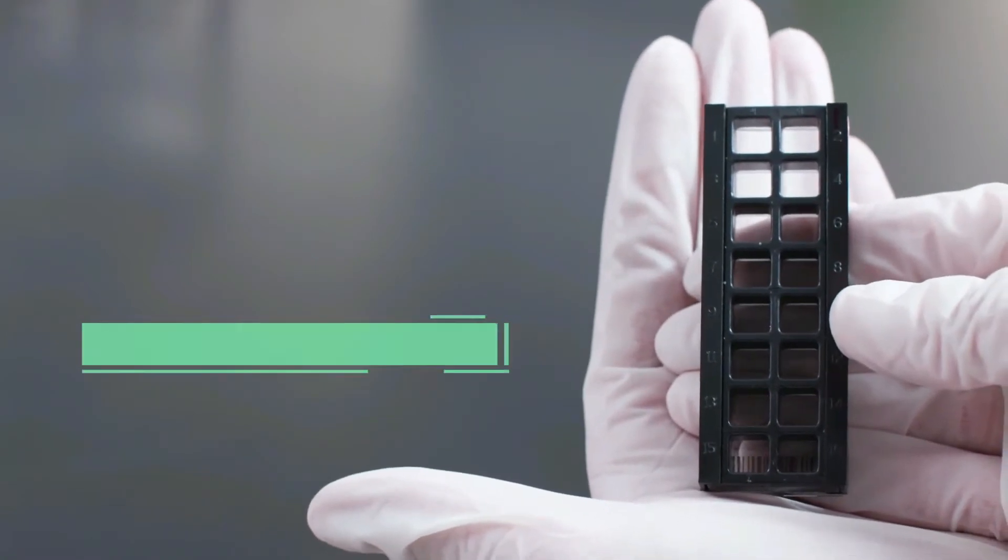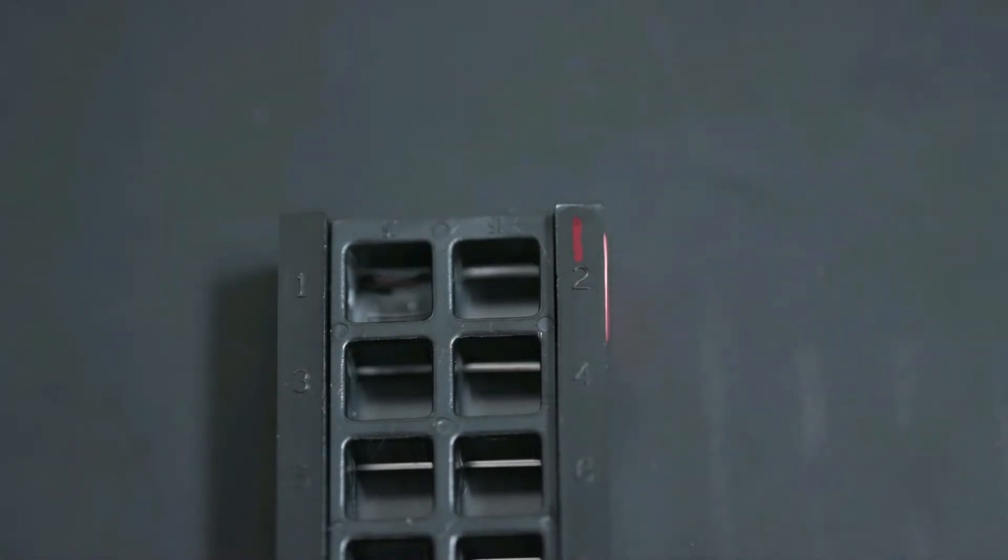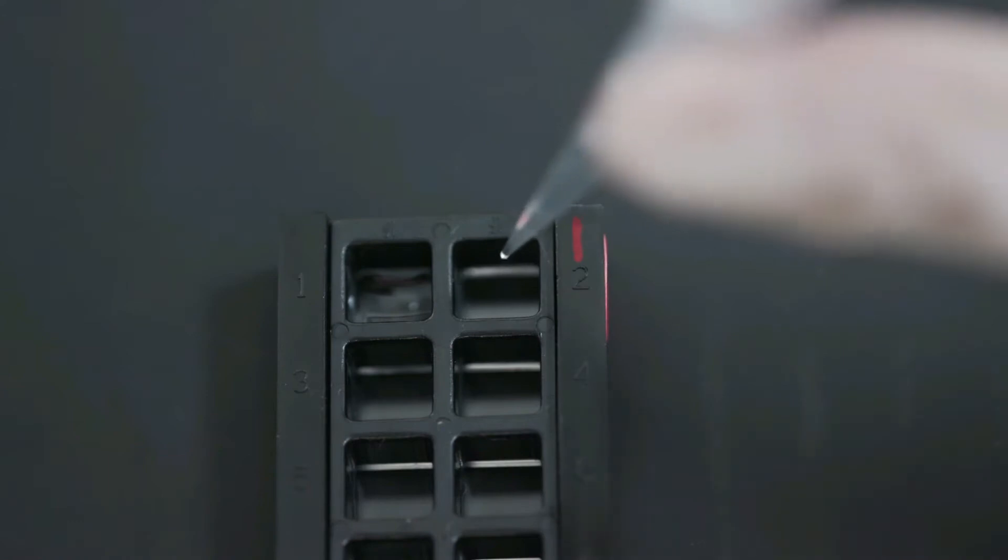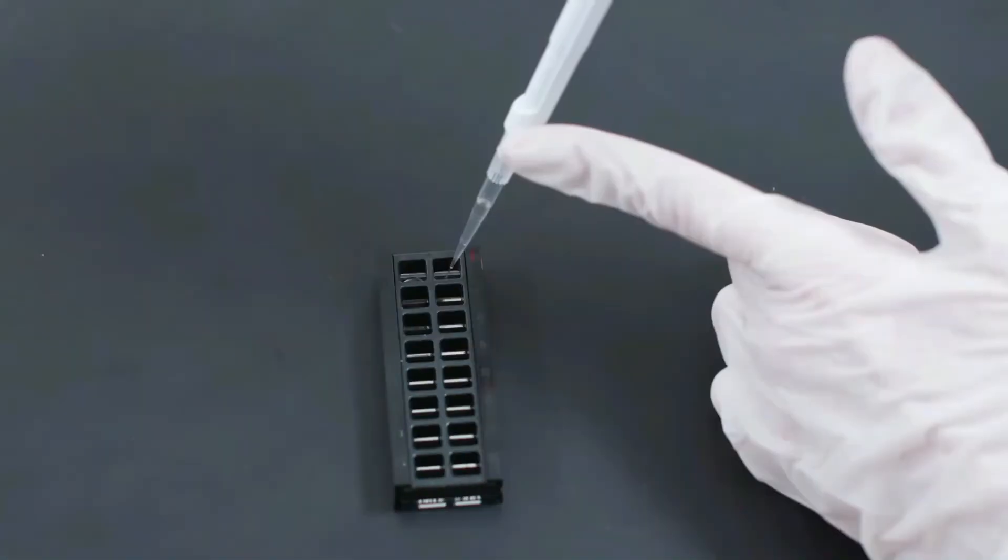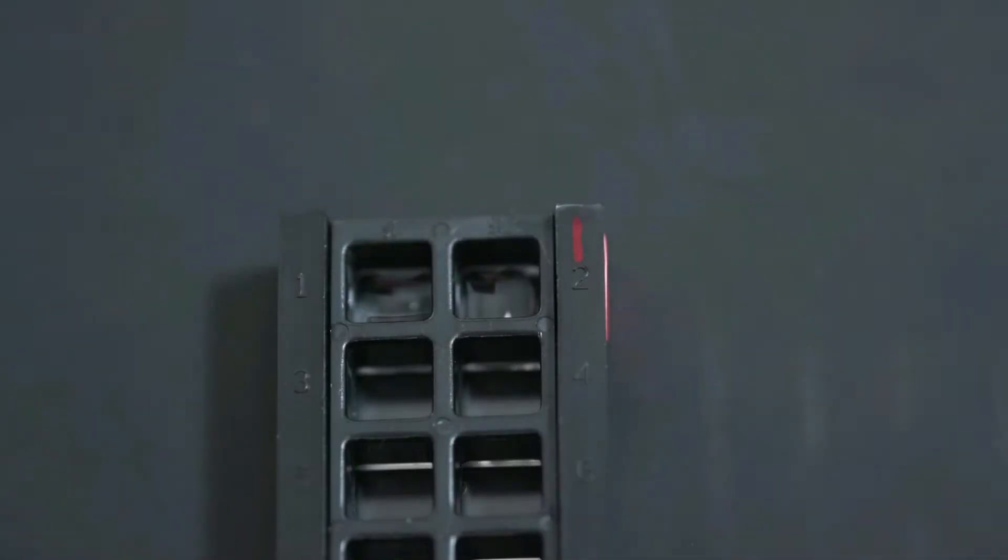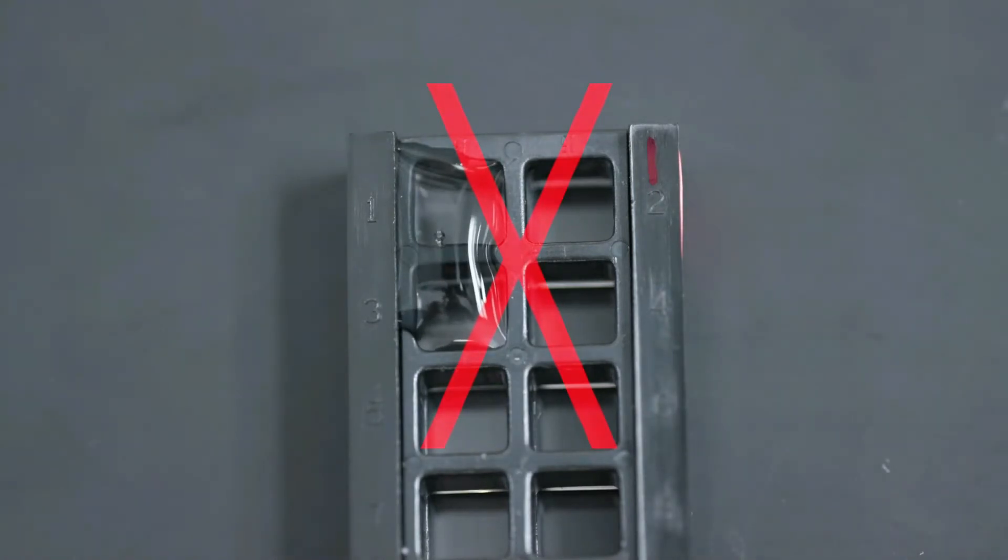When you're ready to begin the experiment, be sure to orient the slide and record which sample or standard is being added to which well. Check your manual for suggested configuration of standards. To avoid smearing the array spots, pipette slowly, and never touch the pipette tip to the glass. Be sure the liquid fully covers the array surface with no air bubbles. Take care not to overfill the wells. This will not happen if you added the recommended volumes of liquid.